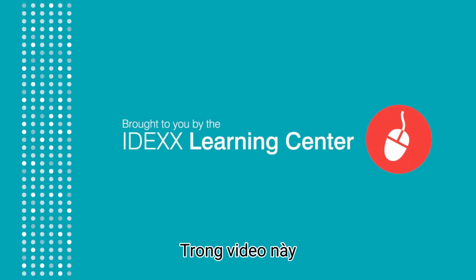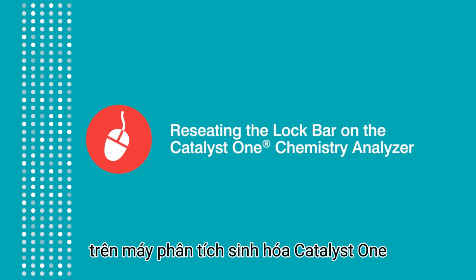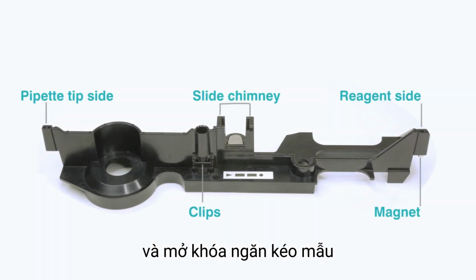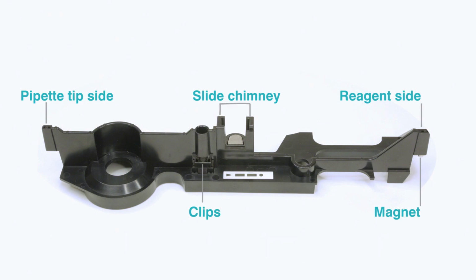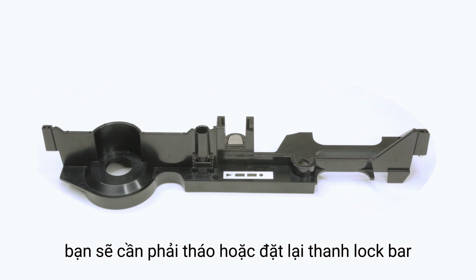In this video, we'll demonstrate how to reseat the lock bar on the Catalyst 1 chemistry analyzer. The lock bar controls the locking and unlocking of the sample drawer. When the lock bar is not seated properly in the analyzer, sample drawer errors can occur. To resolve this problem, you'll need to either remove or reseat the lock bar.